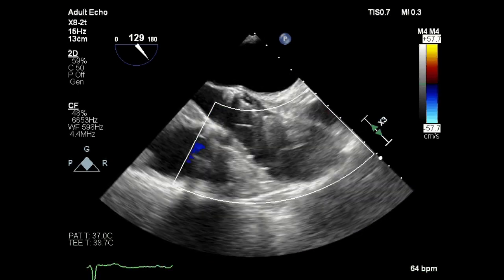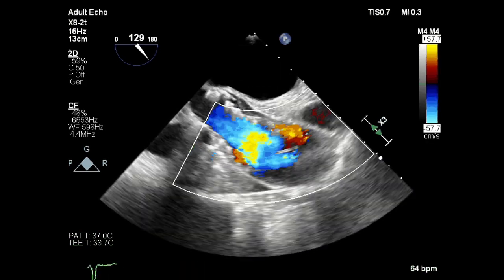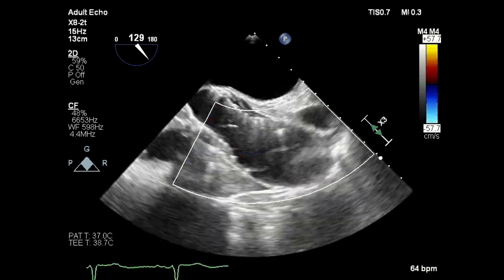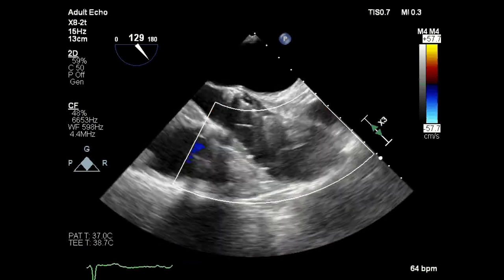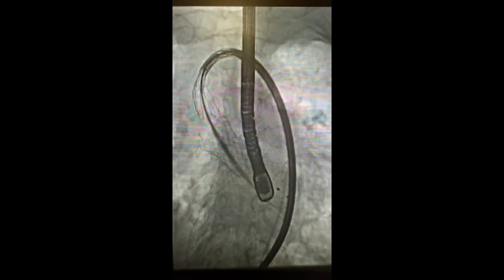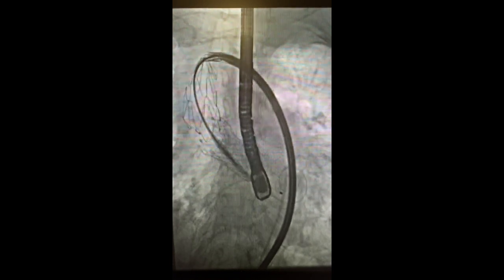Given the patient's previously stated wishes to not have open surgery, the decision was made by the team to treat the dissection with thoracic endovascular aortic repair using an uncovered stent graft. In these fluoroscopy images, you can see us deploying the uncovered TEVAR stent graft. For our choice of graft, we used an uncovered 36-by-80-millimeter Cook Zenith nitinol stent graft.